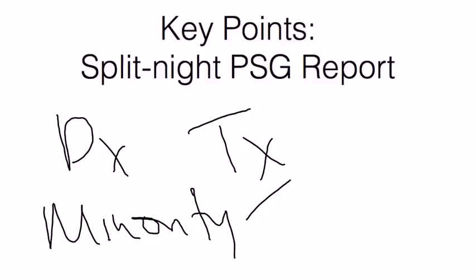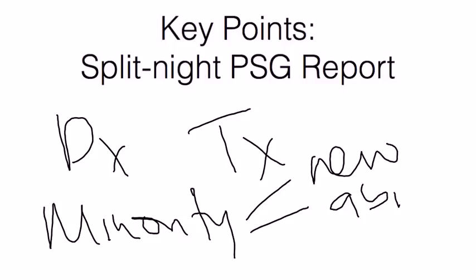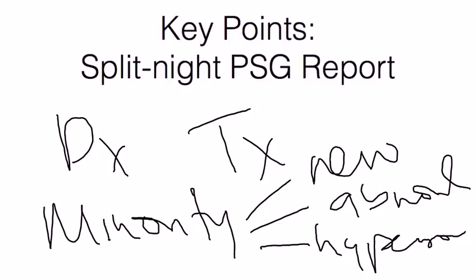These are patients mainly with neurological issues and so on, where there's a suspicion of, for example, nocturnal seizures, patients with abnormal sleep behaviors, for example, sleepwalking, abnormal dreams, and so on. These are even patients with hypersomnia, so they're excessively sleepy, to the point of suspicion for hypersomnia or narcolepsy, for example, then a full night sleep study would be required. All right, so that's the definition.